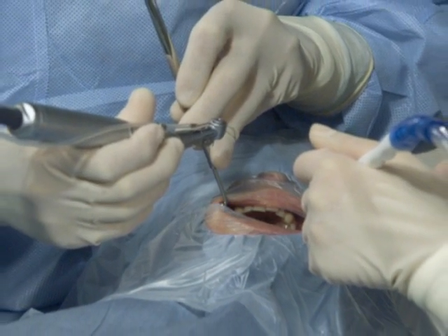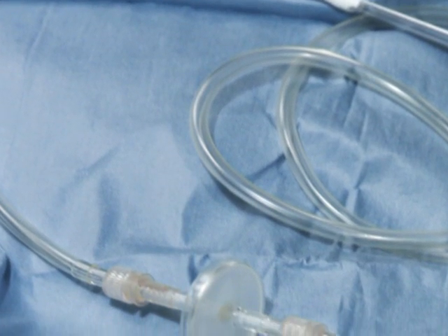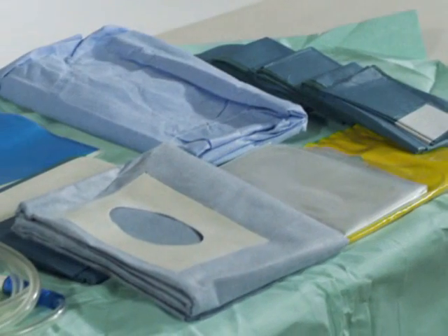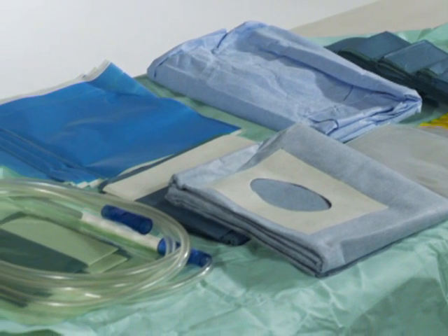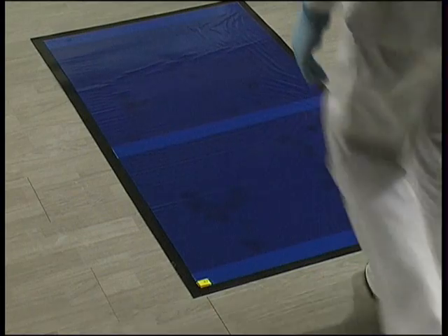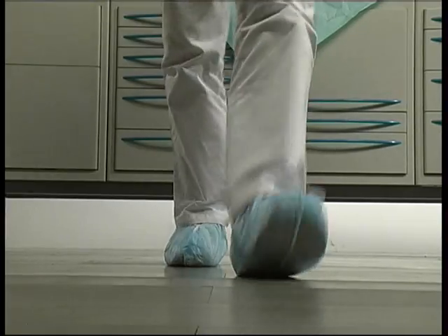The ideal surgical team should comprise at least the following: one doctor, one sterile assistant, one non-sterile assistant. Prior to the operation, we need to verify the tasks of each operator. Using aids such as the decontamination mat or overshoes, we can limit the bacterial load in the surgical environment.